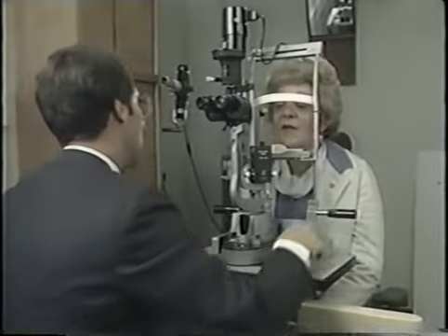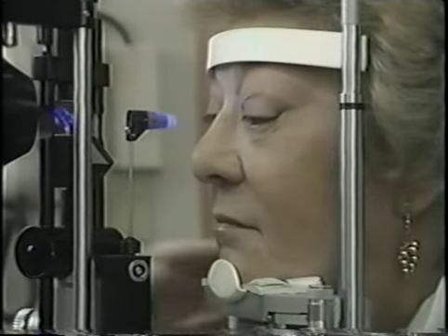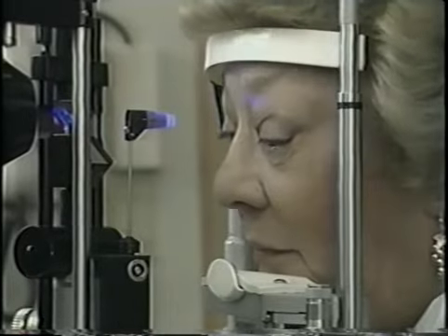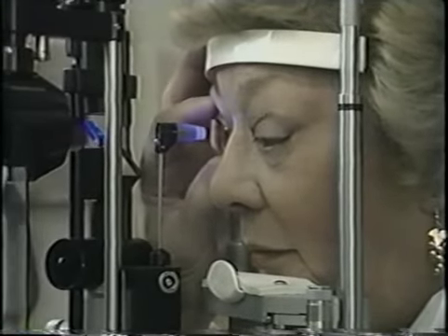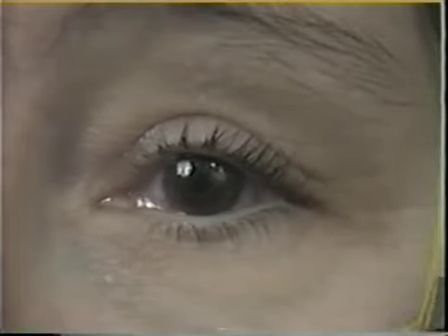After determining intraocular pressure in primary gaze, the patient's chin should be placed behind the chin rest while the forehead is positioned against the forehead rest. Intraocular pressure is then checked with the patient looking up. If nystagmus is present, it is important to have the patient fixate in the field of gaze that maximally diminishes the ocular movement.